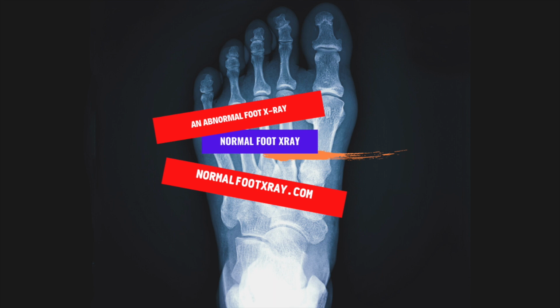An abnormal foot X-ray is useful for detecting broken bones or dislocated joints. It can help determine how well a bone is healing after surgery. An X-ray can help physicians plan and evaluate the success of surgeries. It can also detect tumors or cysts that may be in the feet or bones. A routine foot X-ray will tell a doctor about the exact location of a tumor or cyst.